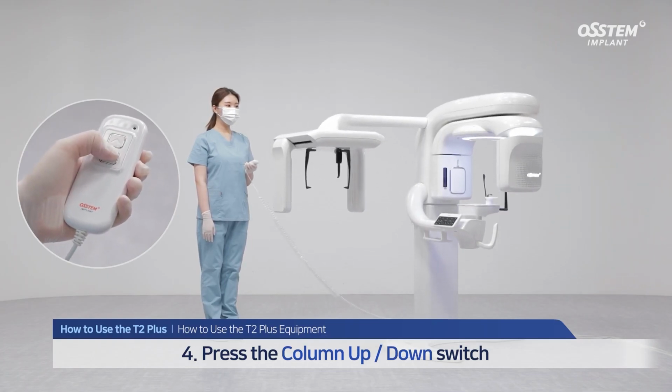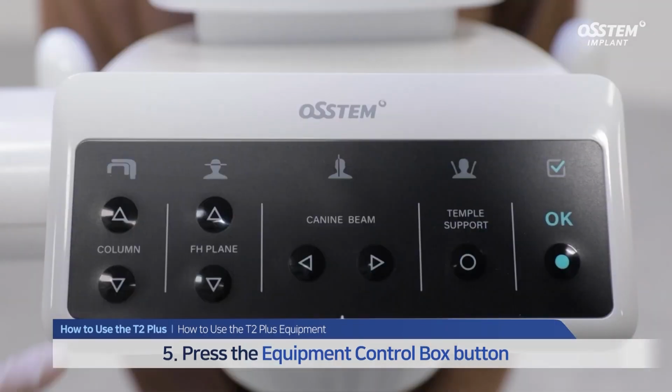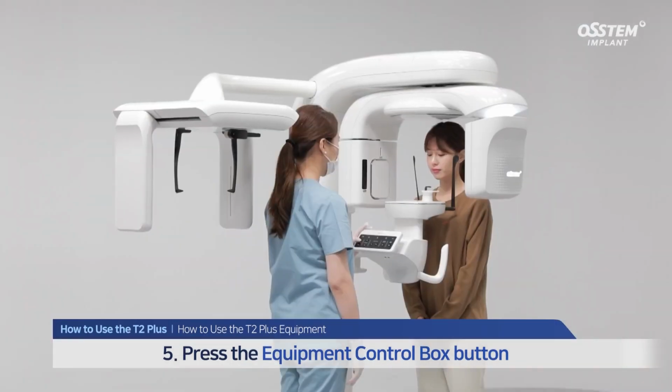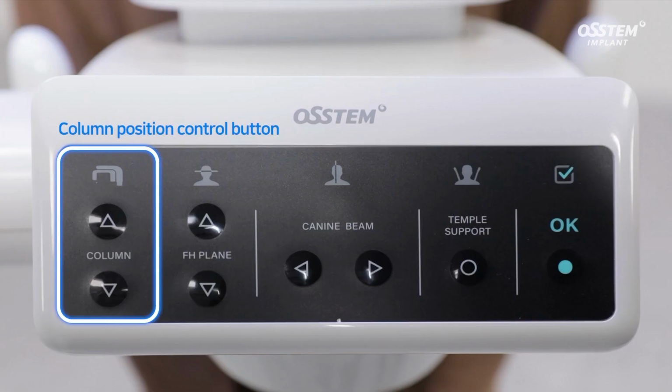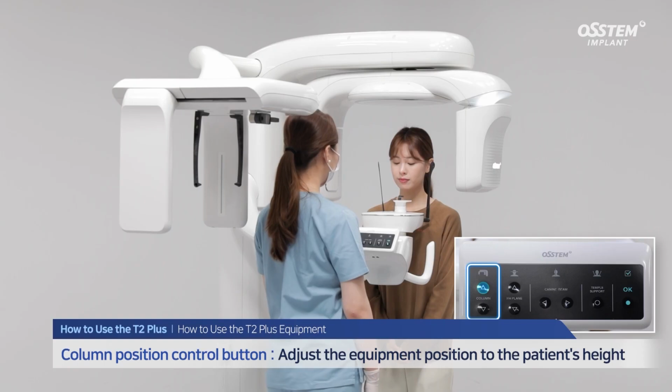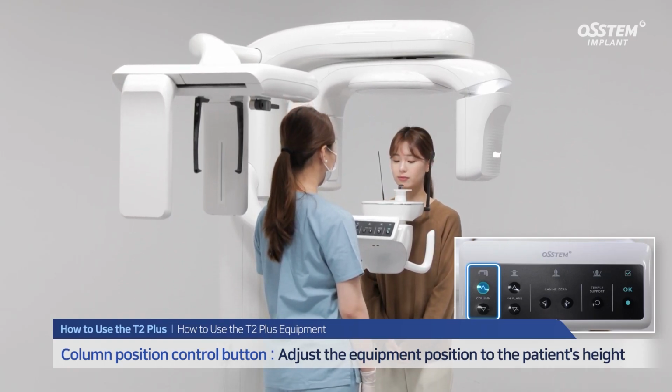You can adjust the height using the up or down switch on the side of the equipment. To position the patient for scanning, press the equipment control box button and check whether the equipment works properly. Using the column position control button, you can adjust the position to the height of the patient.